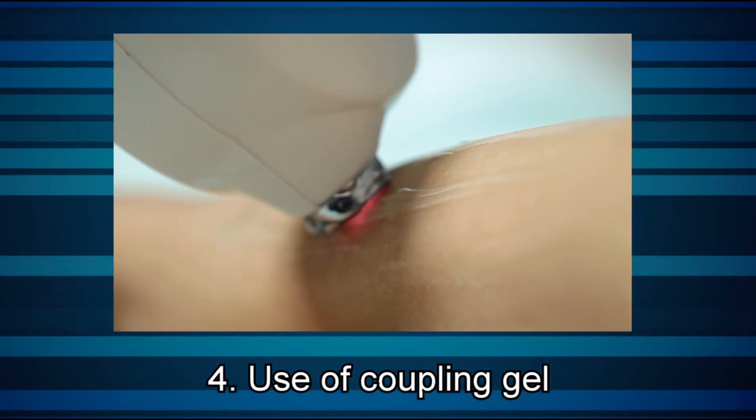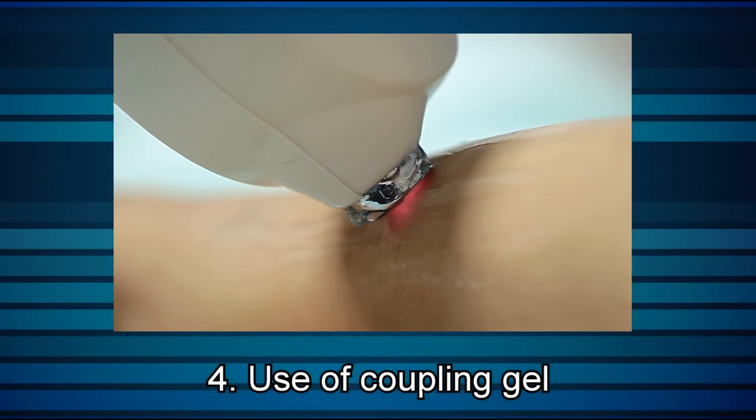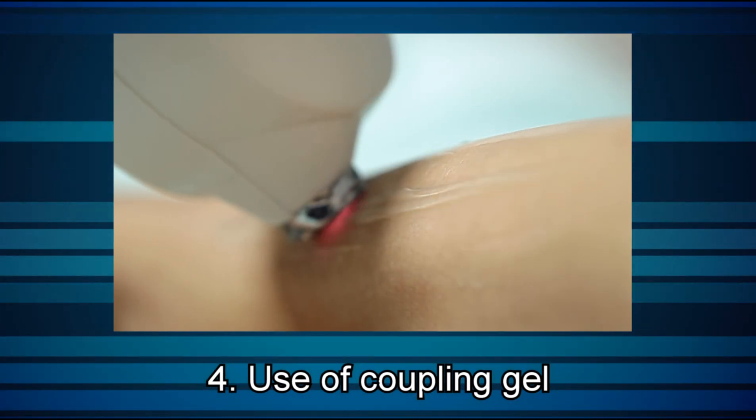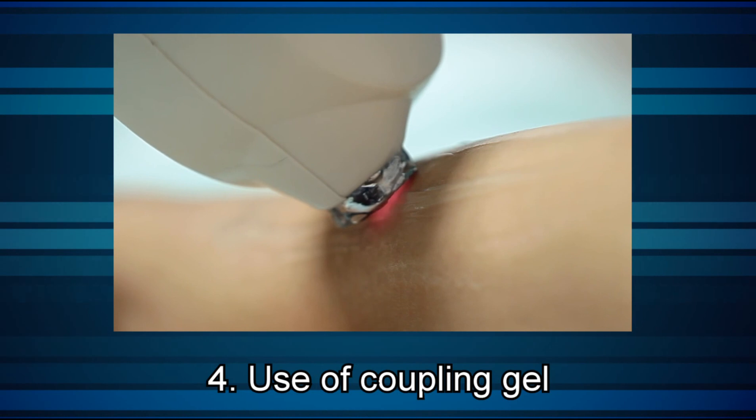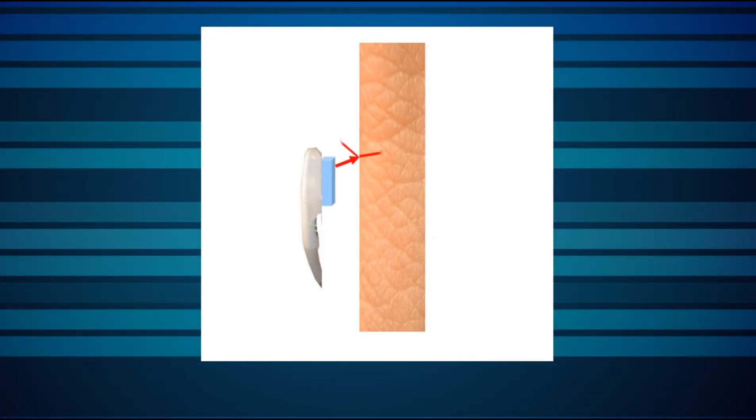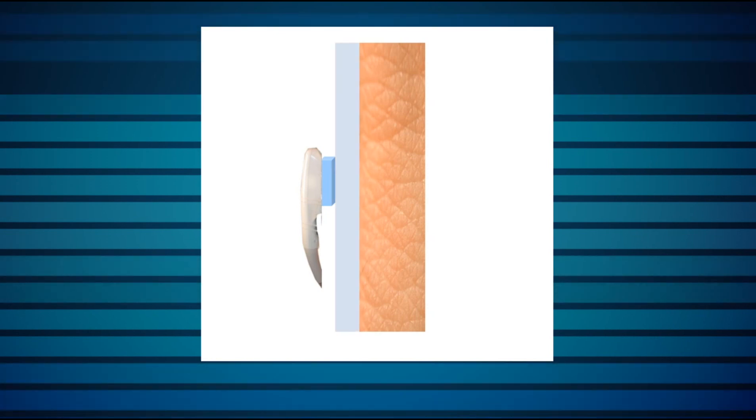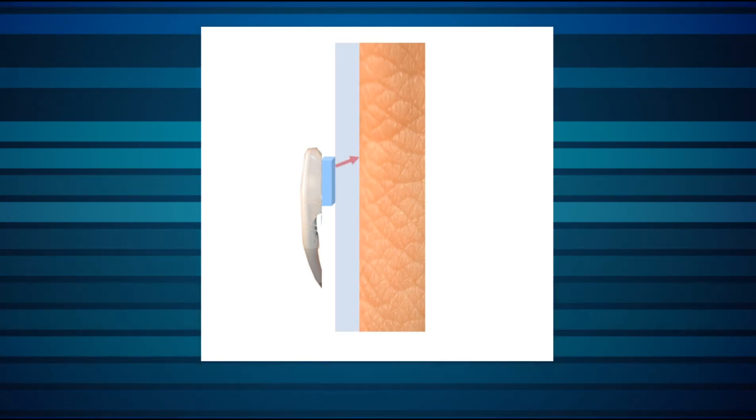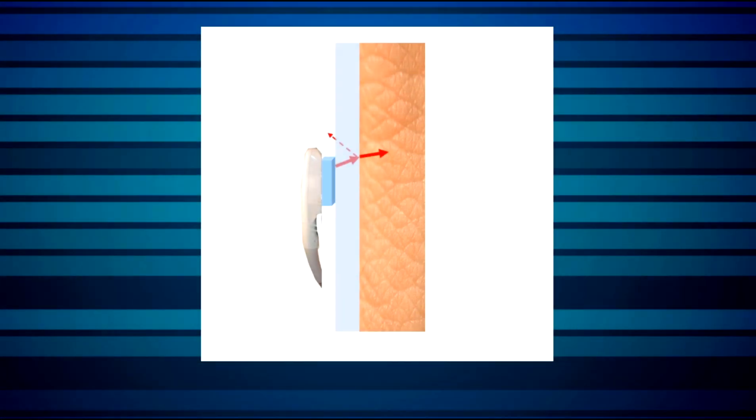4. Many, if not most, IPL applications involve the use of optical coupling gel on the patient's skin to reduce reflective losses as the light goes from one optical medium, air, to another, skin, by reducing the step size of the refractive index. For the measurement to have maximum clinical meaning, it should be performed under similar optical conditions to those of the IPL's clinical use.